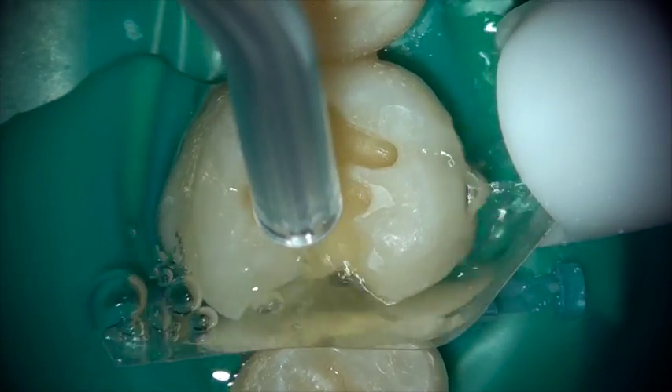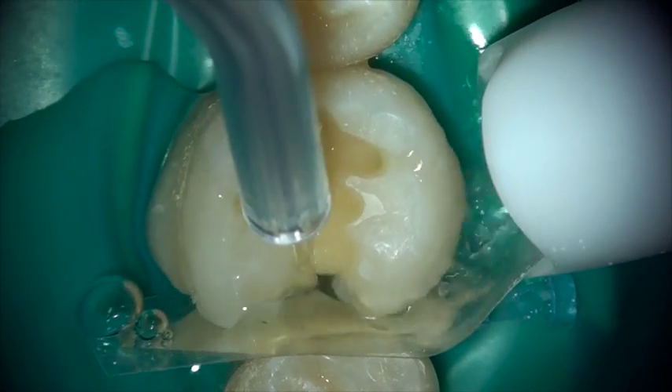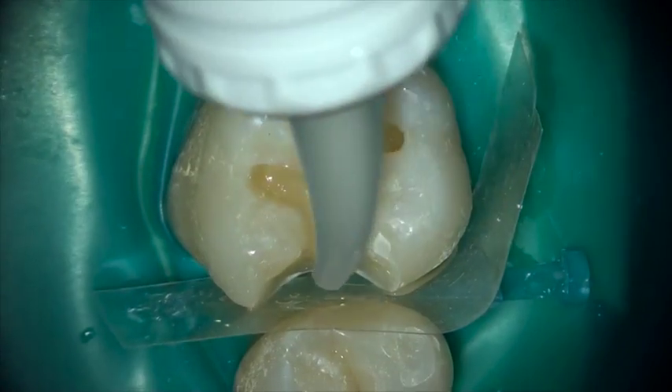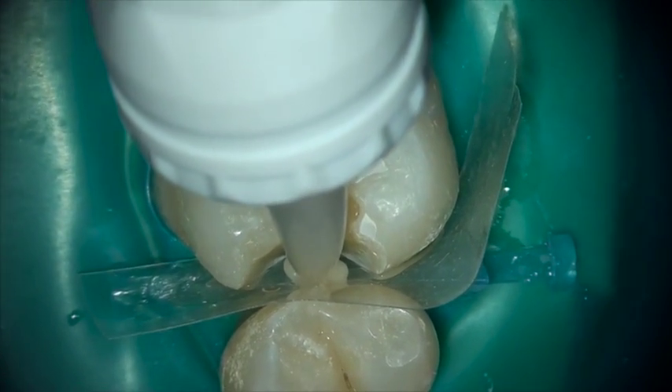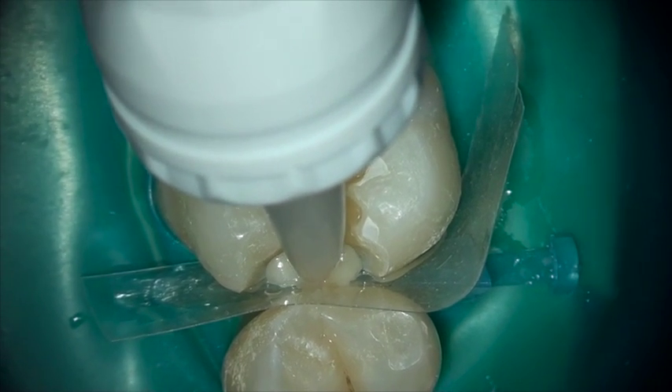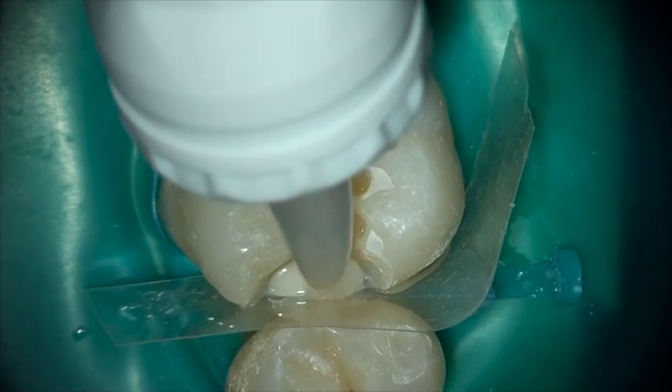Simply wash the conditioner away, leave the tooth slightly moist, and then place the Equia Forte into that deep portion of the box, bringing it up to a margin level that you are comfortable with for your composite restorative. Once the material has set, we move to the next step.